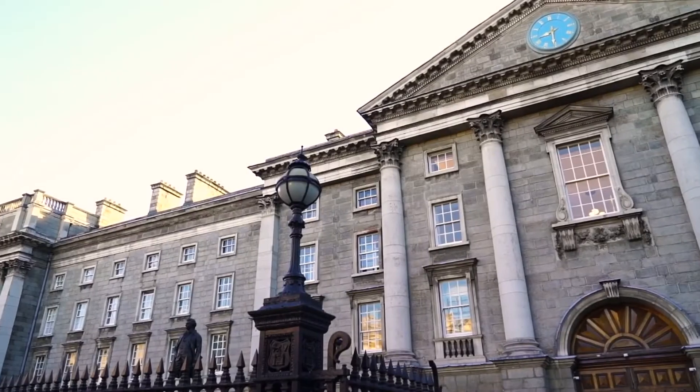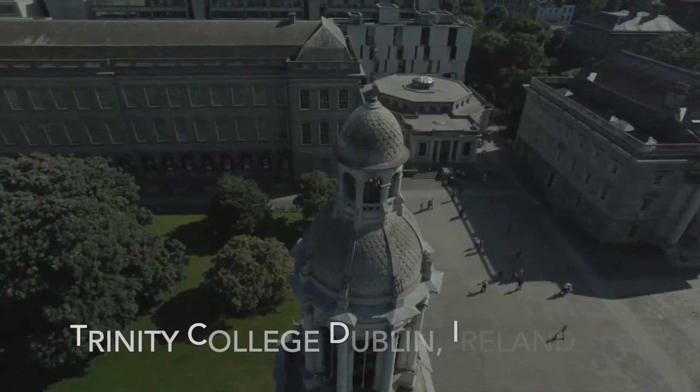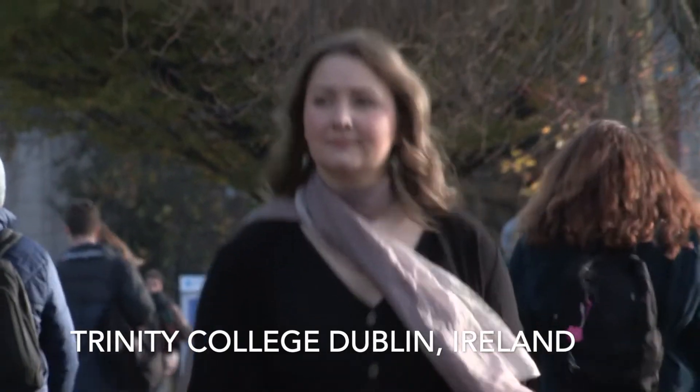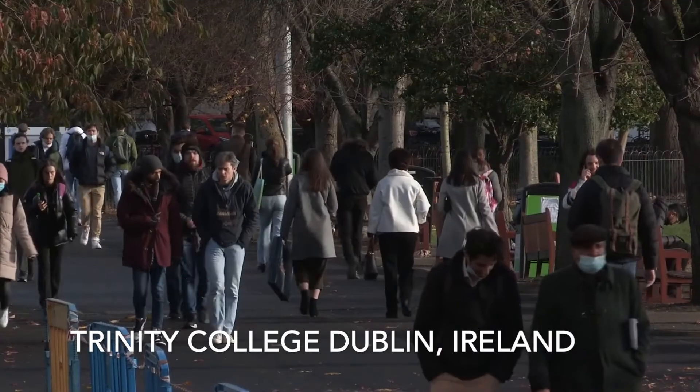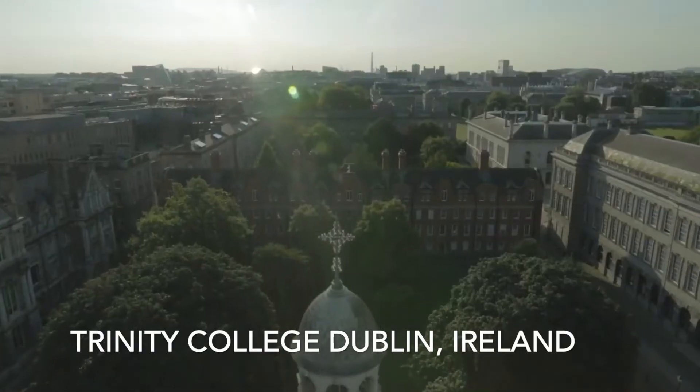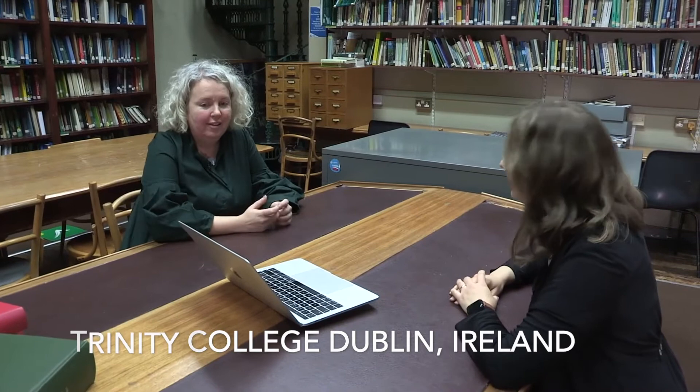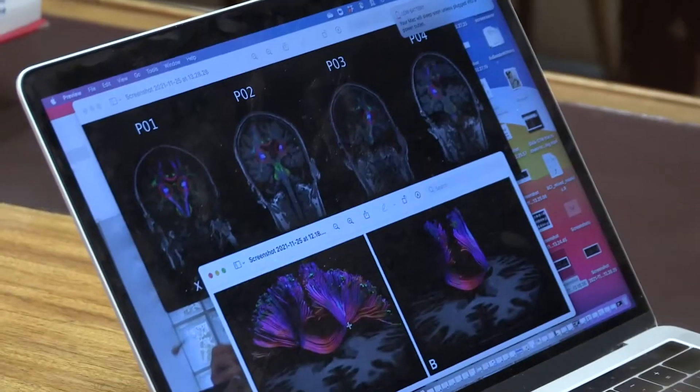My name is Cathy Ruddy and I am a research assistant professor at Trinity College Institute of Neuroscience. In my lab we're testing a novel multimodal brain computer interface incorporating transcranial magnetic stimulation which is TMS and EEG BCI.